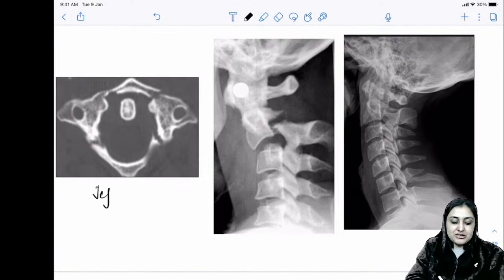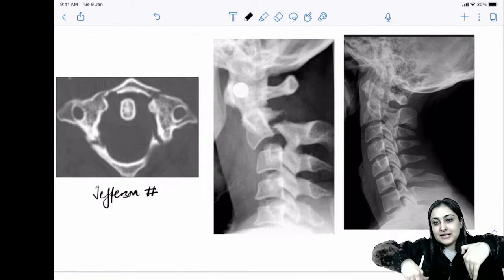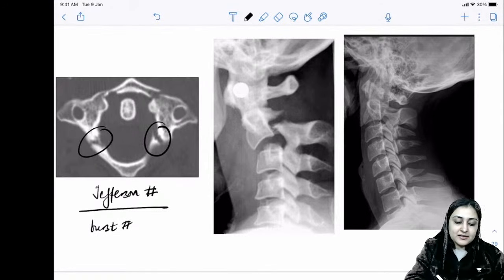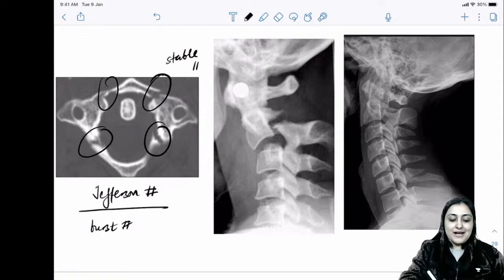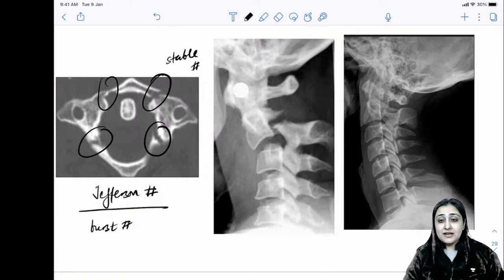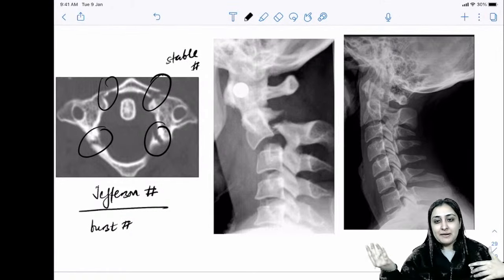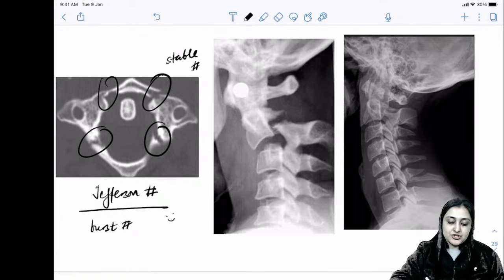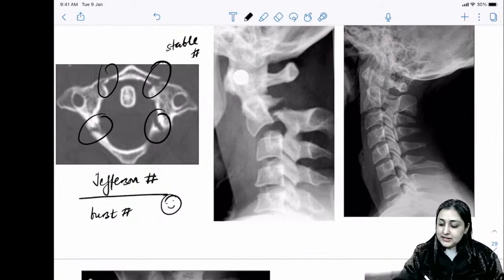Spine fractures: Jefferson's fracture is a burst fracture of the atlas (C1) — a four-part ring fracture from diving (axial loading). Surprisingly, it is a stable fracture with no neurological impact.